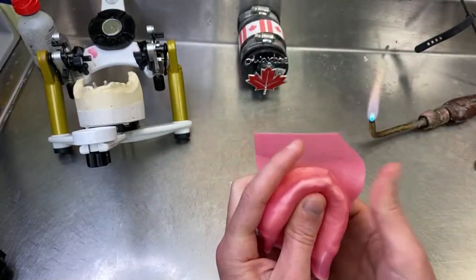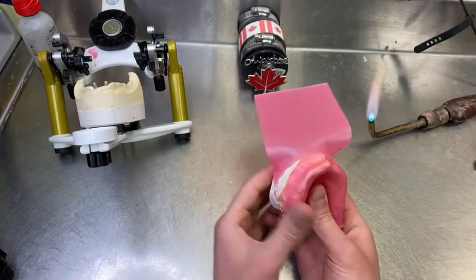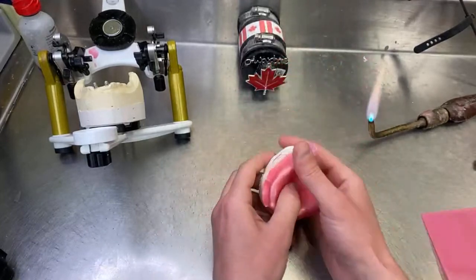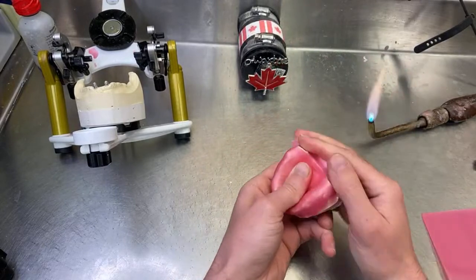Okay, so this is only wax here going on the base plate. Just make sure you adapt it well.